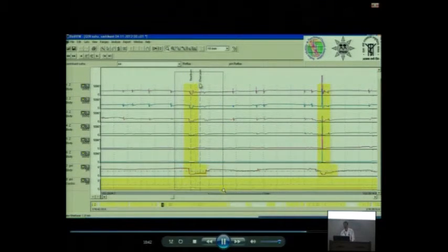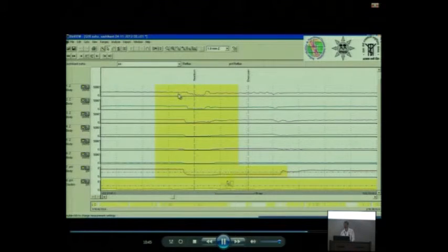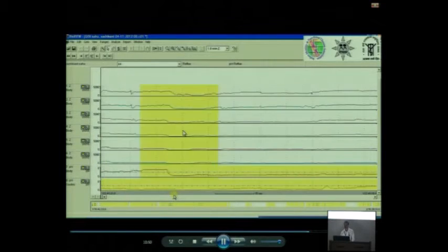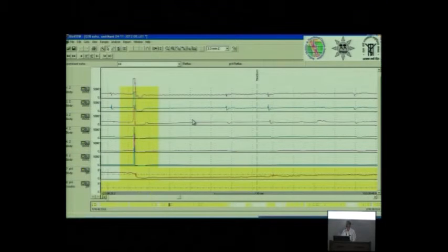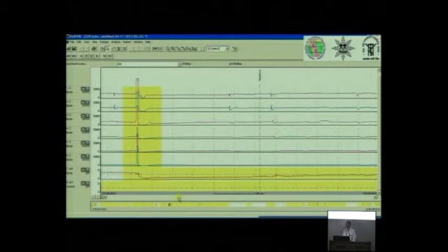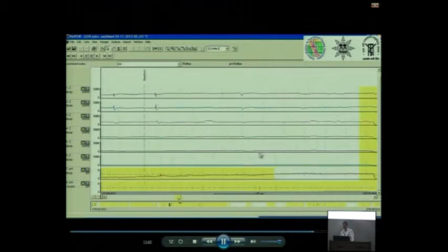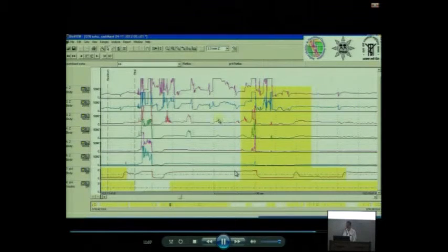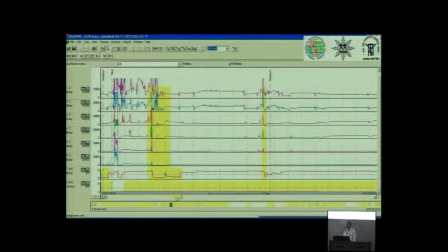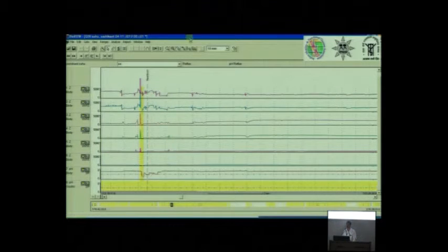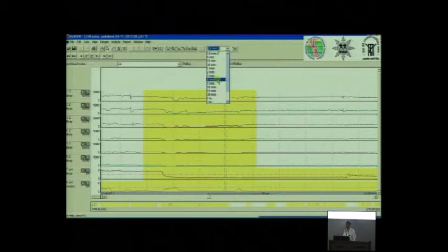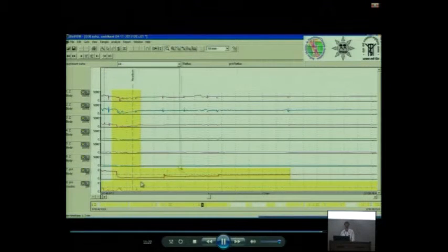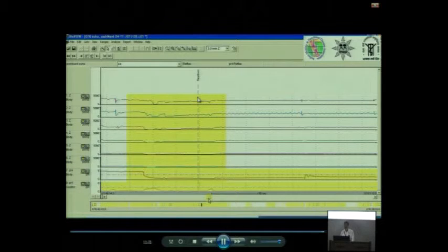This patient also clicked the key of heartburn over here. Look at this, there is a reflux which is acidic because pH has gone down, impedance also dropped, and the patient has clicked on heartburn key. So there is a beautiful correlation where you got a liquid coming out, the liquid is acidic, and patient pressed on heartburn. Whereas look at this, here patient has pushed heartburn but there is no reflux. What is symptom sensitivity index? Symptom sensitivity index is when somebody has heartburn, how many times there is an acidification of the esophagus. If it is more than 50 percent of the time that each time patient says heartburn, more than 50 percent of the time if esophagus has become acidic, this is an evidence for reflux.